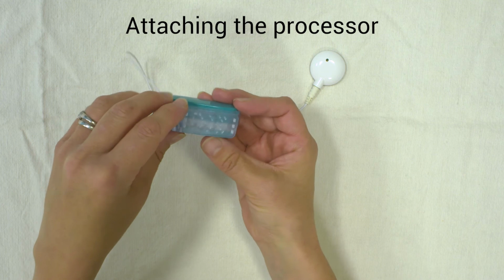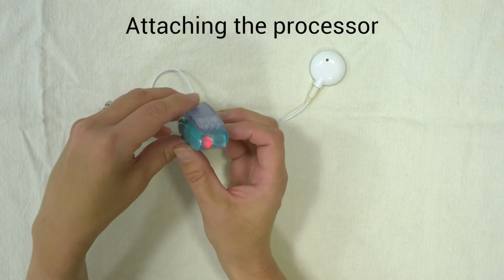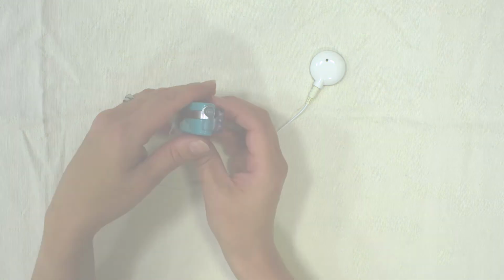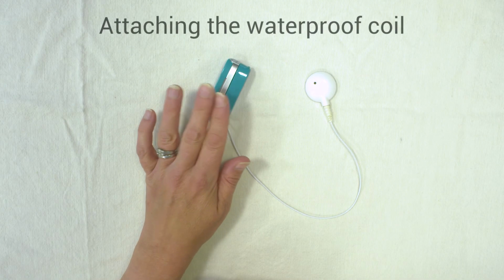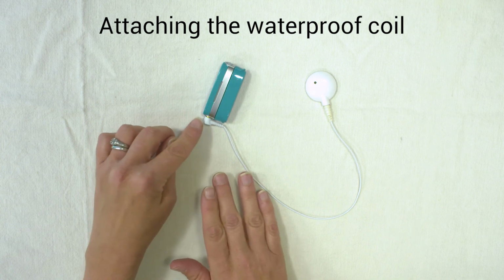For different wearing options, it'd be a good idea to discuss that with your key worker or audiologist if you're having difficulties. Although the Neptune processor is completely waterproof, in order to use it in water, you need to change the coil and cable.